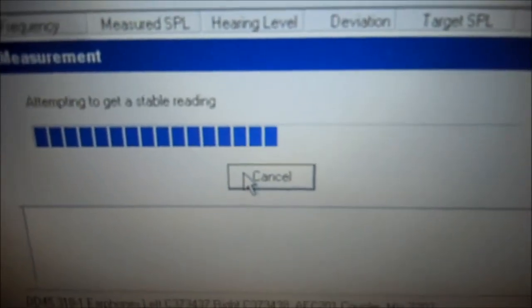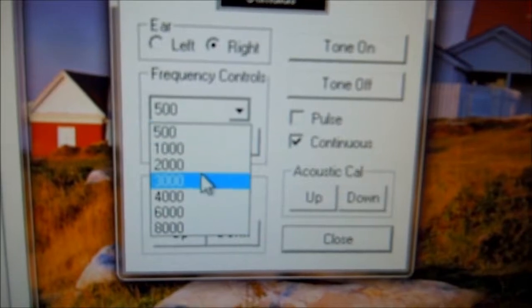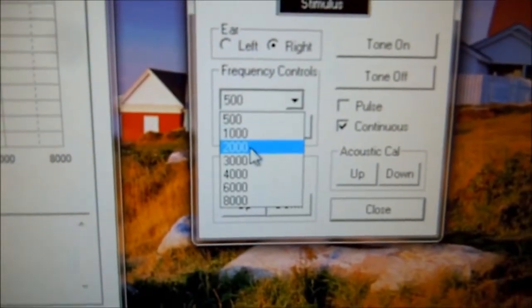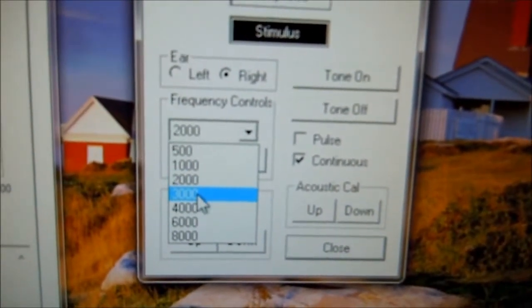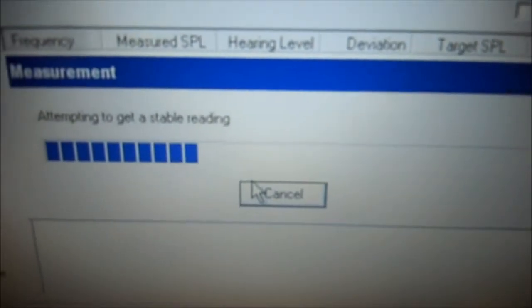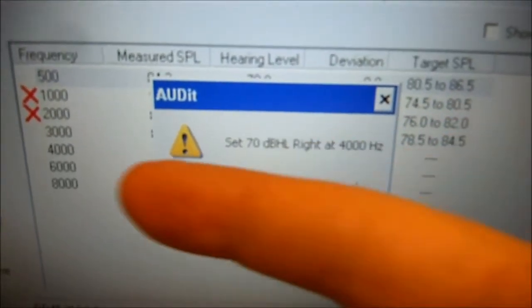And it's going to measure. We're going to do that at 1,000. Come back to the audit software, hit OK. And we're going to do 2,000. And as you can see we already have an error at the 1,000 and 2,000, which we will adjust once we're finished measuring all of these.